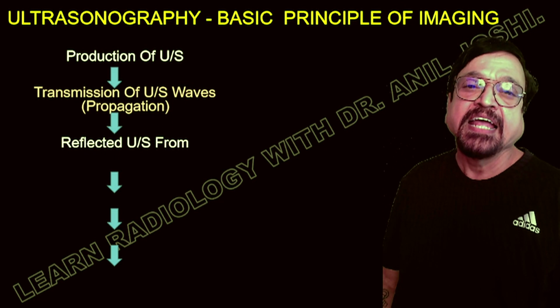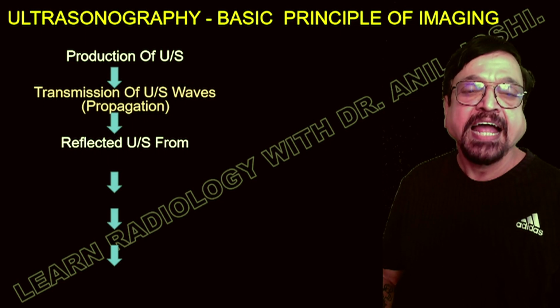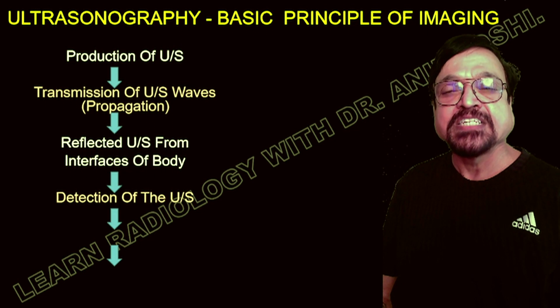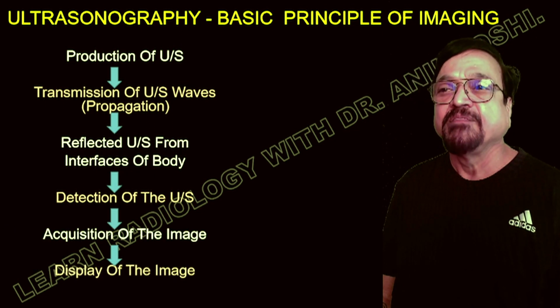Now here we are shown in a diagram how the production of ultrasound wave is done by transformation of the electric energy into mechanical and then into ultrasound, then again back, and that causes a crystal to vibrate, and that again gives a signal, that is, conversion of ultrasound wave into electrical energy. So that is how the phenomenon takes place, and we get the images.